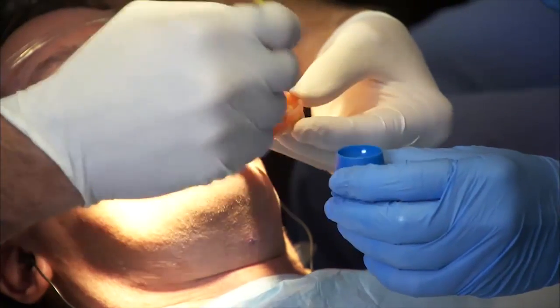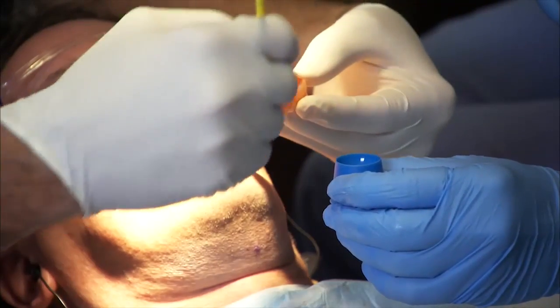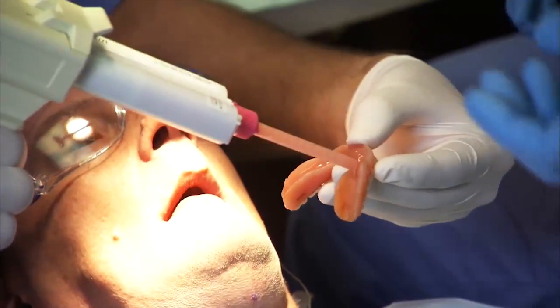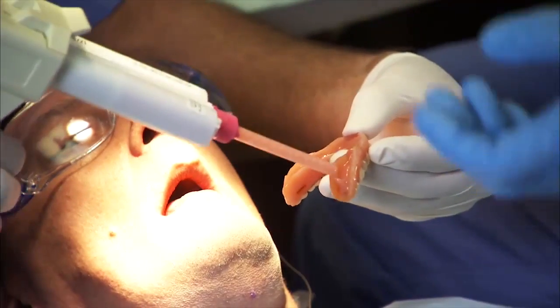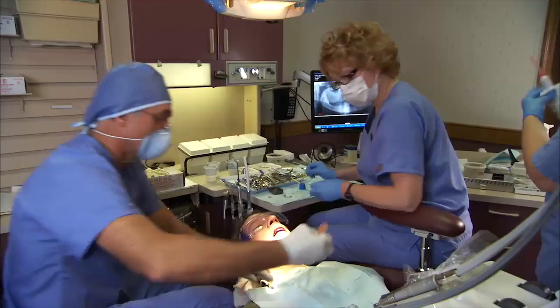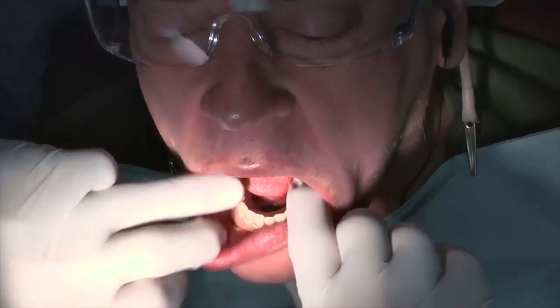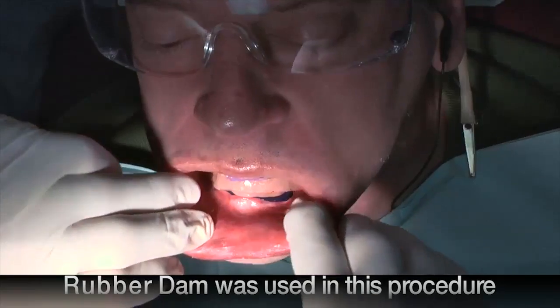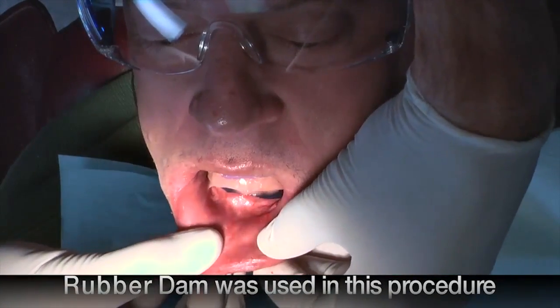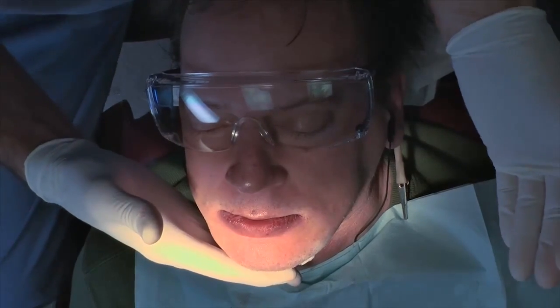You can apply petroleum jelly to the exterior acrylic to avoid unintended bonding of the reline material. Next, extrude the hard pickup material into the trough of the denture and directly into the housings still passively attached to the abutments. Carefully insert the denture over the housings and have the patient apply normal biting pressure for 7 to 9 minutes until the hard pickup material has firmly set. This creates a firm fixation of the housings to the denture at the correct position for each abutment.